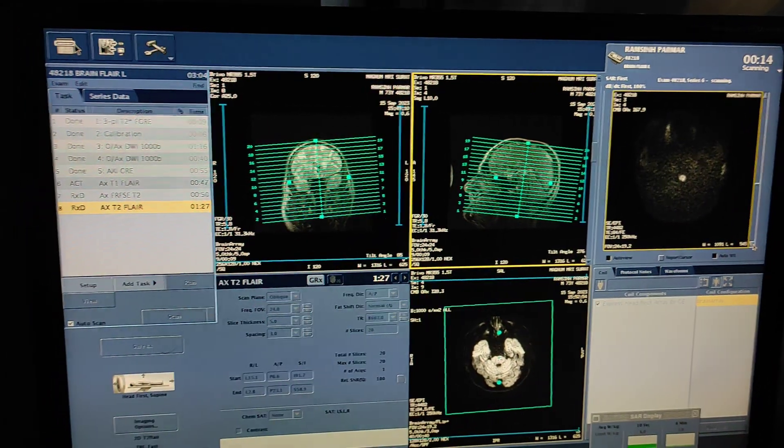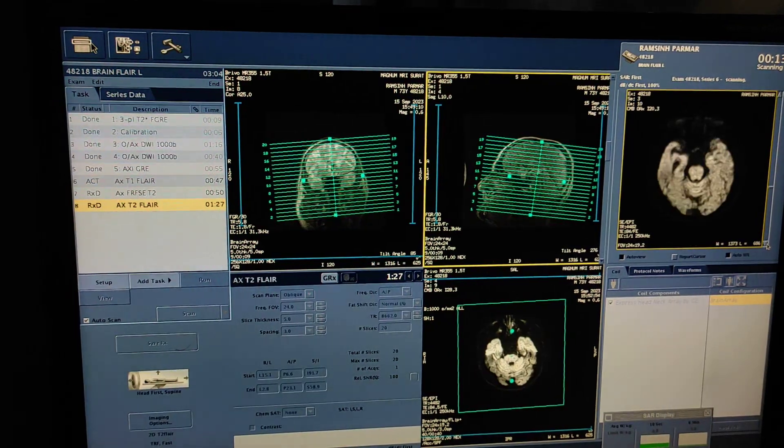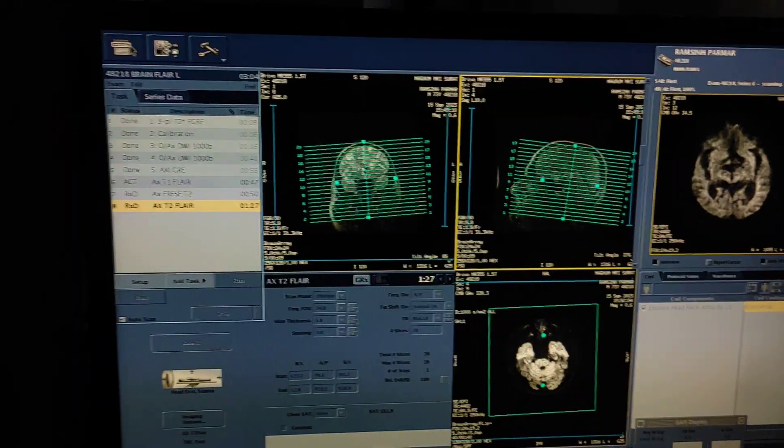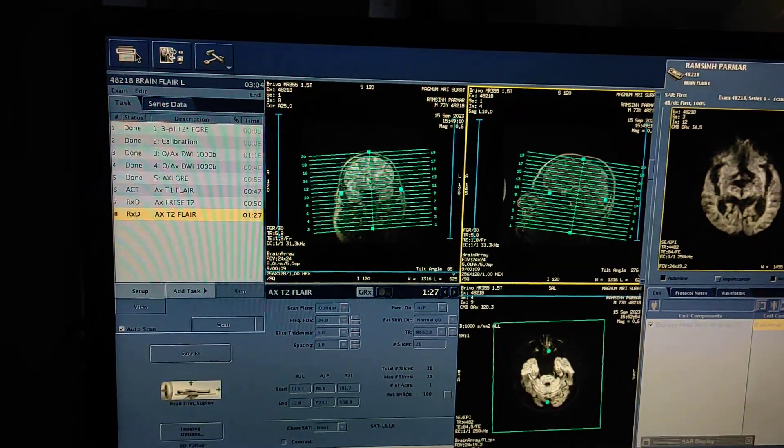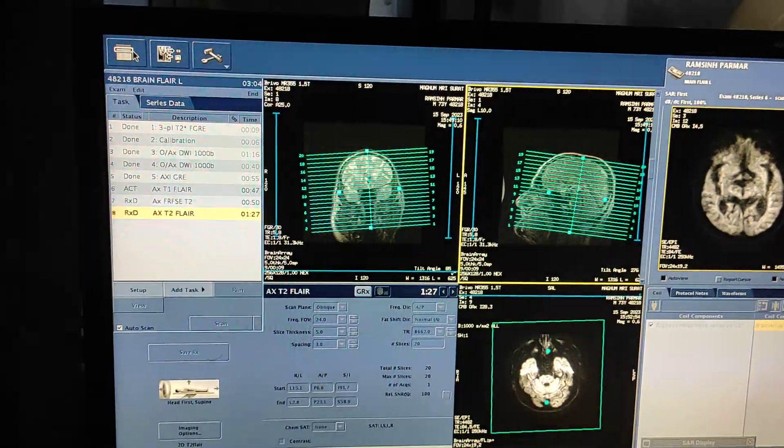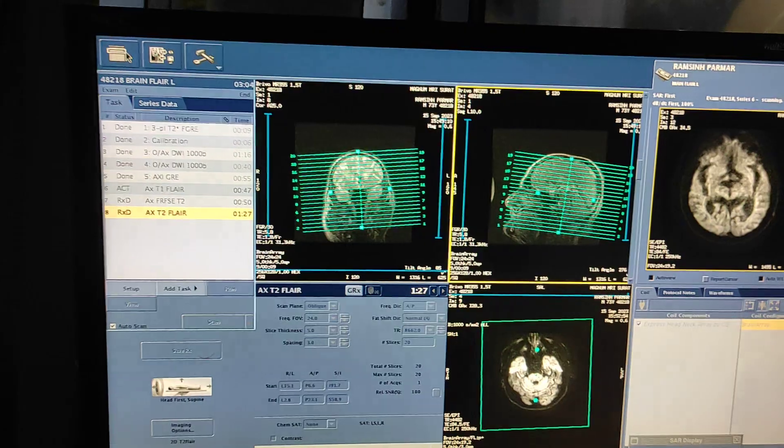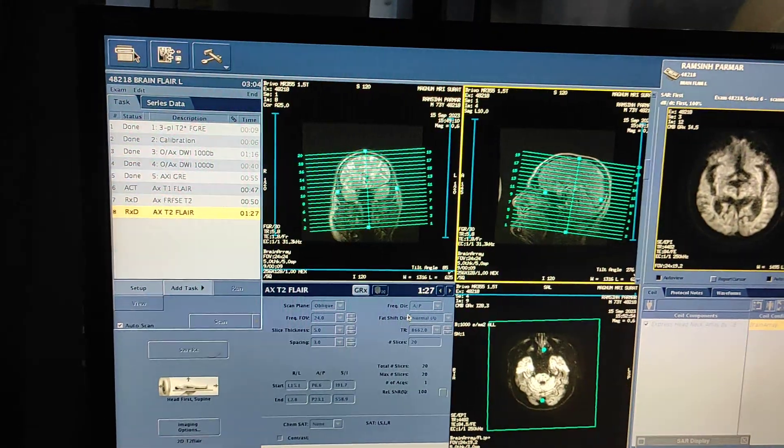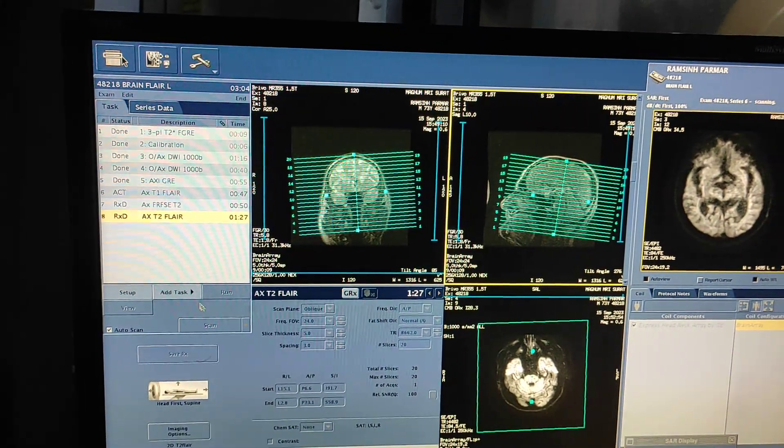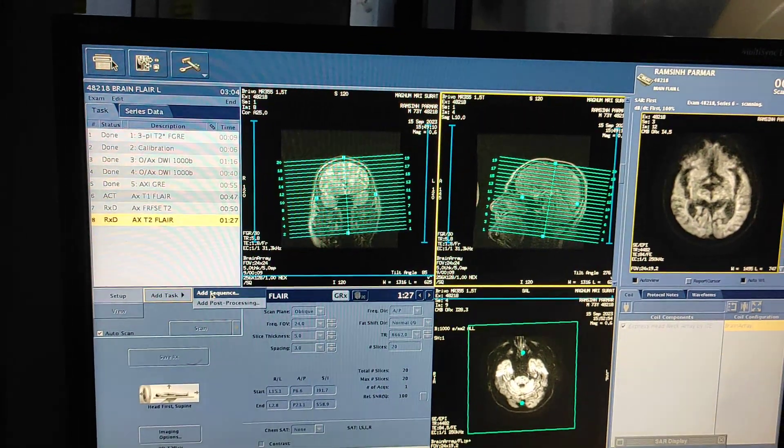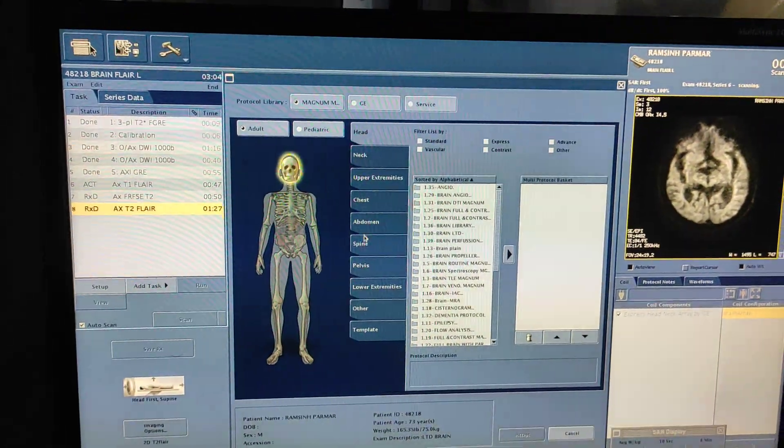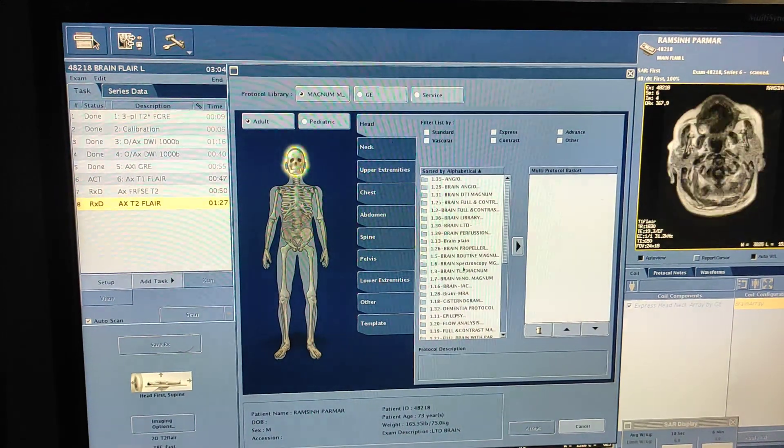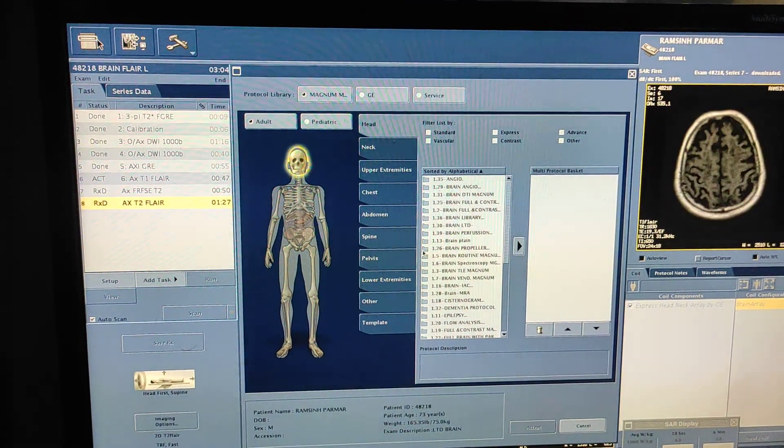In this case you have to use a propeller sequence. Propeller sequence is a motion correction sequence. So what I will do is I will go to the propeller protocol.